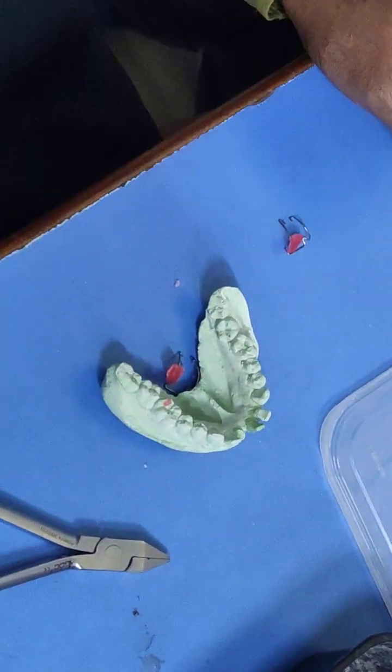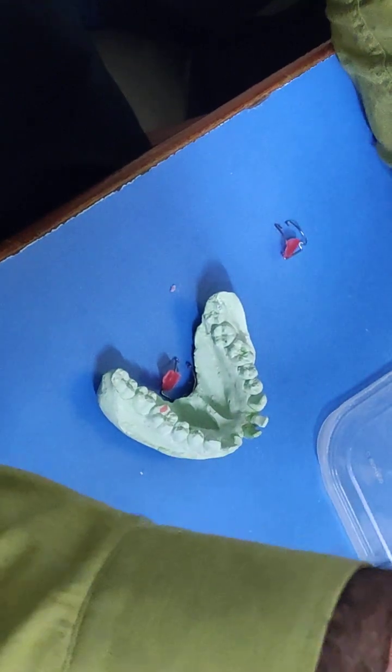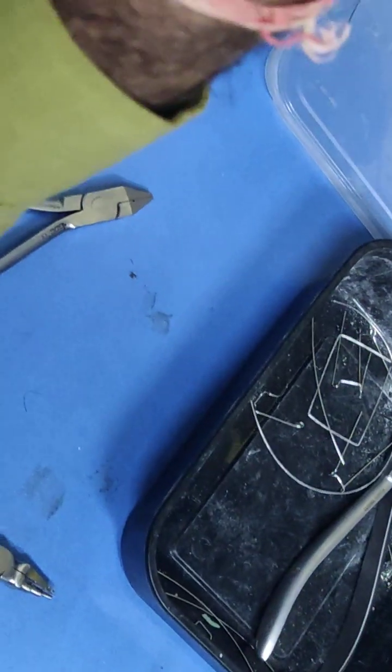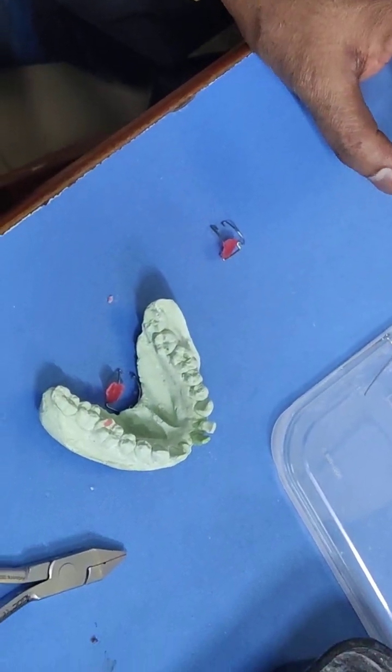But the problem is that the flexibility of that wire becomes more, so control of the tooth movement will be relatively difficult. So if it is not necessary at all, better make a small U-loop labial bow in all cases. I have made the bend at the mesial end of the canine. And now the height.